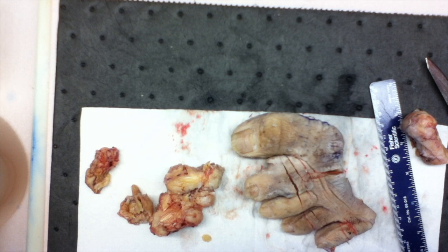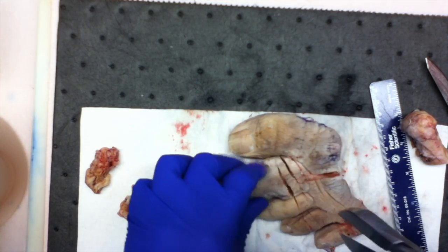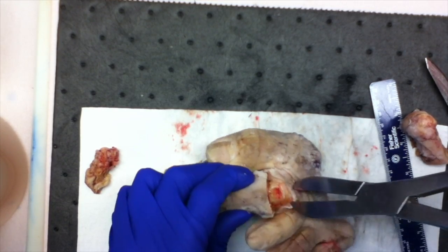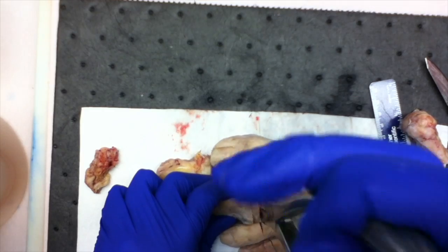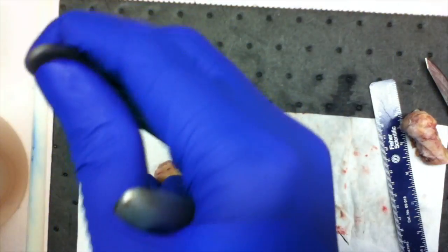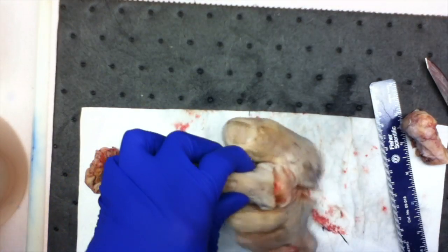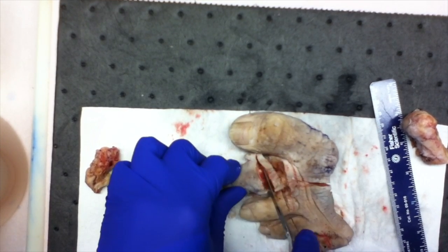Last time on the toe I did the hammer and knife. This time, because there's so many that I gotta do, I'm just gonna take these snips. So here's my snips. They work pretty good doing smaller bones like this. Okay, so there's our bone. Oh, there you go. Alright, that's the second proximal phalange.